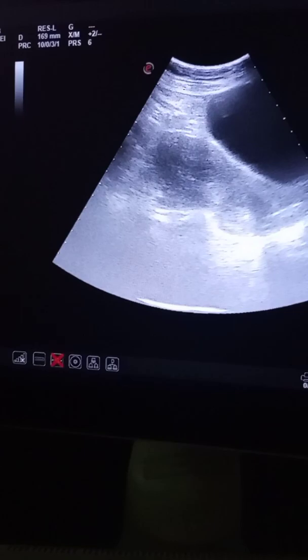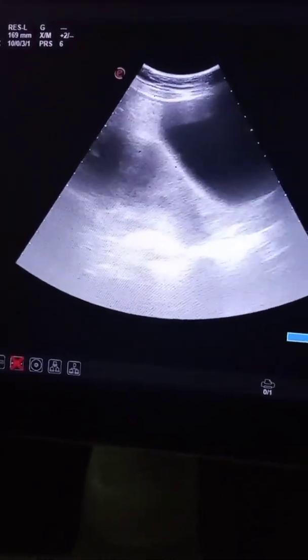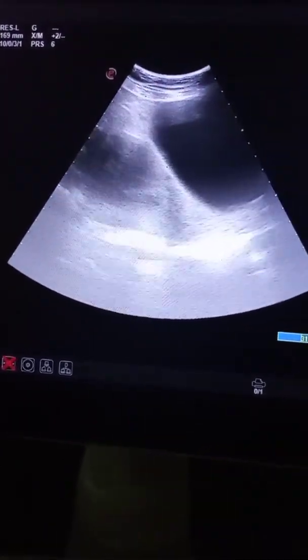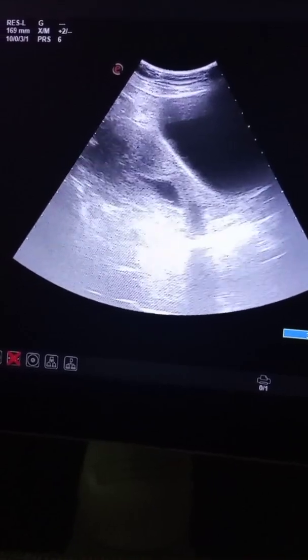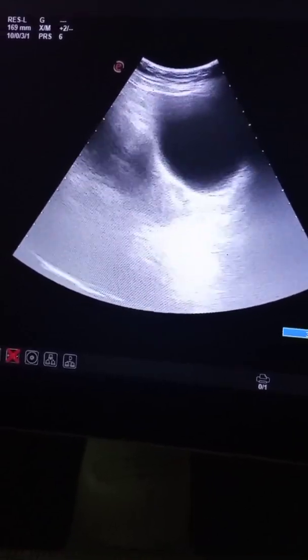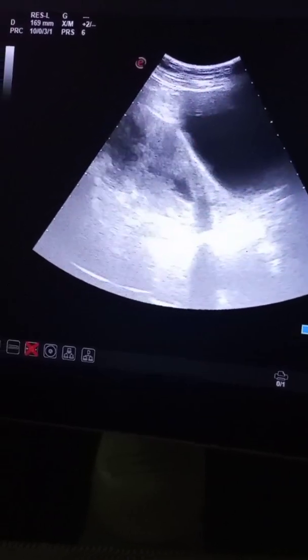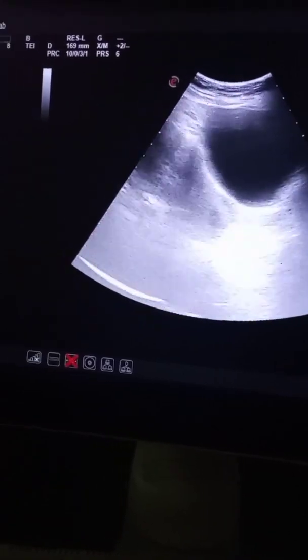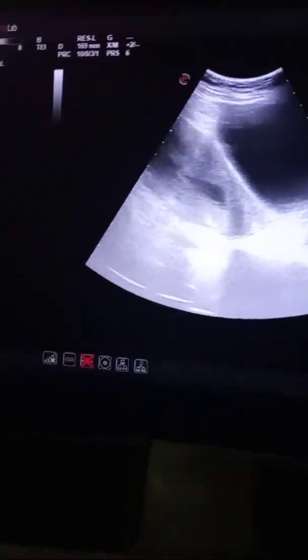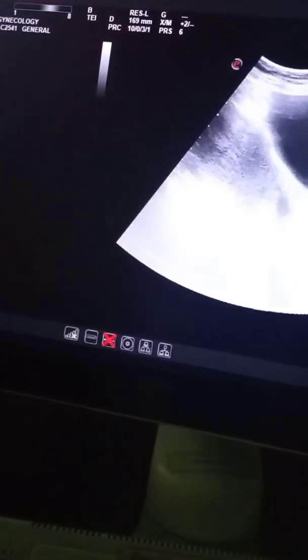You can see that this gestational sac is not present in its original position — it is present in the lower uterine segment, and this sac is without any fetal pole or yolk sac. I have elongated the sac for you, and you can see there is no free fluid in the endometrial cavity or in the surrounding spaces.